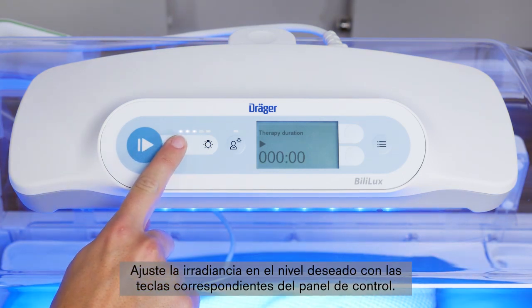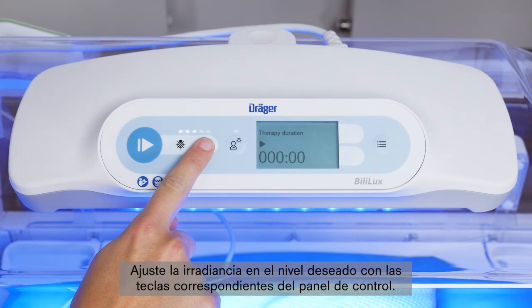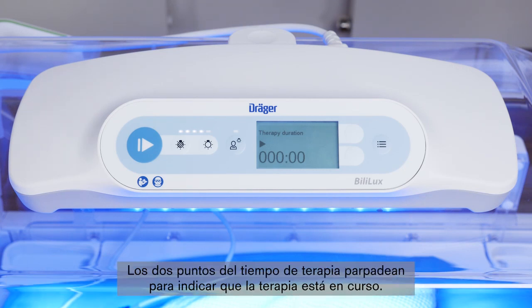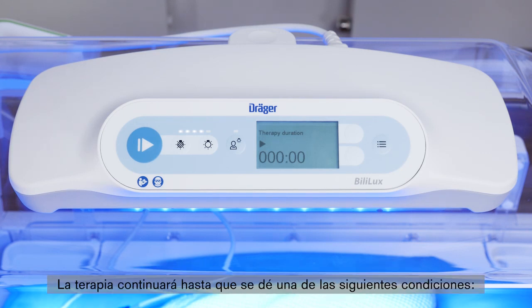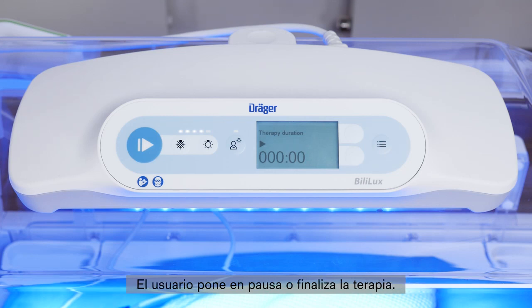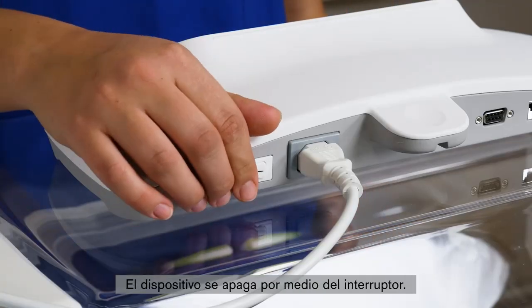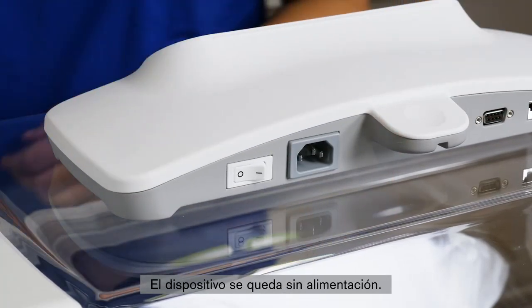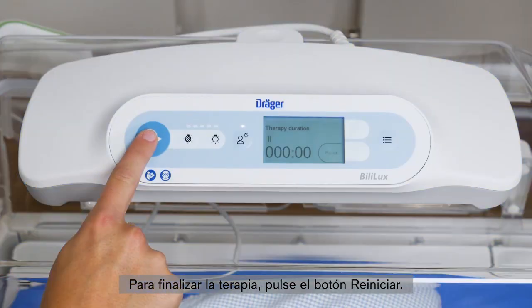Adjust the irradiance to the desired level using the irradiance keys on the control panel. The phototherapy screen shows the elapsed therapy time in hours and minutes. The colon in the therapy time blinks on and off to indicate that therapy is in progress. Therapy will continue until one of the following occurs: therapy is paused or ended by the user, the device is turned off via the on-off switch, or the device loses power. To end therapy, press the reset button.